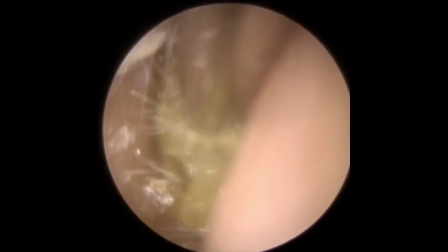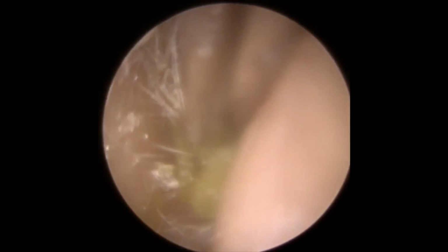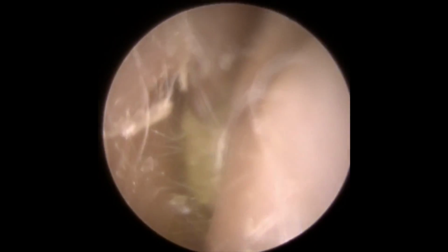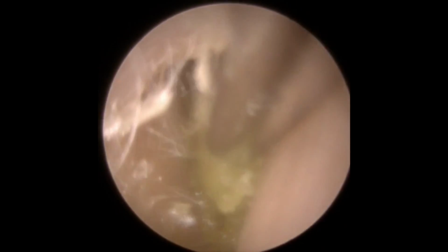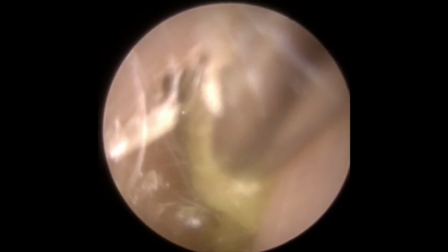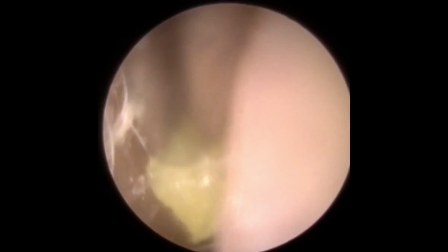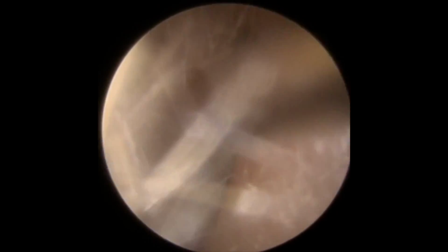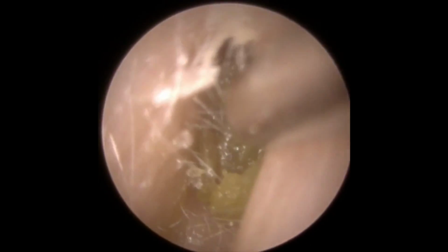So what we're having to do is hold on to this hard lump, bring it towards the front of the canal and try and wedge it in that entrance so that we can start breaking little pieces off it so that we can get it out of the ear canal. Okay. Now, the difficulty you have with the fine end is that when it does start breaking pieces off, only a tiny piece breaks away, it means that end blocks. So we have to keep unblocking the tube. So we have to keep going in, out of the ear all the time.